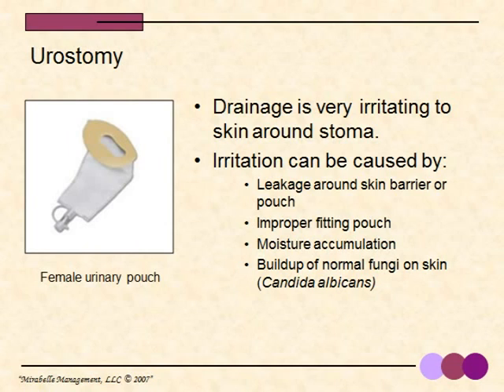There may be irritation from an improper fitting pouch or an accumulation of moisture and buildup of normal fungi on the skin, leading to a yeast infection that we call Candida albicans.